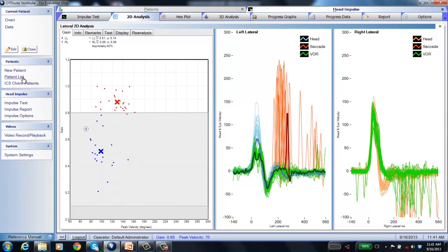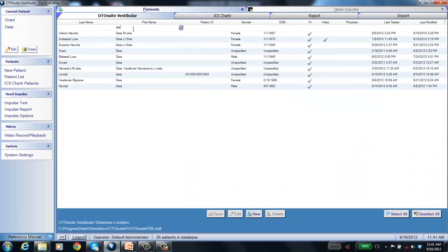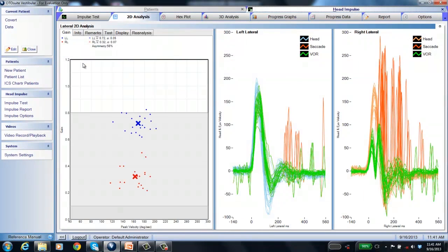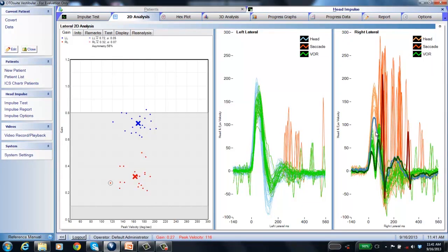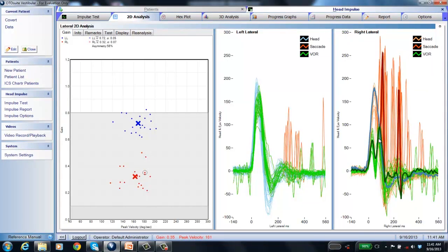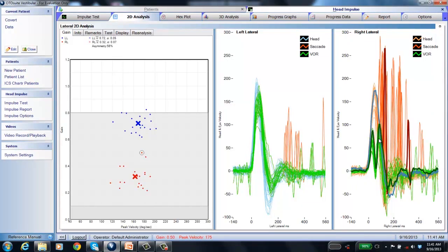Looking at a covert catch-up saccade patient: the right side is actually the abnormal side, but it's so abnormal it pulls down the good left side, which is very typical. The first catch-up saccade is occurring during the head movement. Sometimes more than one catch-up saccade occurs as the eye tries to return to the fixation dot — covert followed by a small overt. These catch-up saccades clearly occur during the head movement — that's an example of covert.